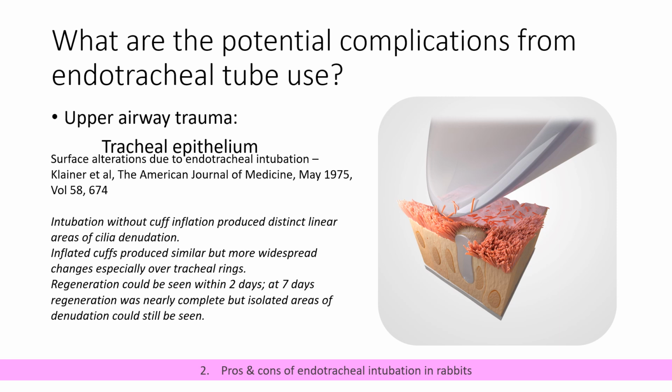When you intubate, as you can see, anywhere where you touch on that ciliated epithelium, you are amputating those cilia from the surface of the epithelial layer, and as you can see, it takes quite some time for them to grow back. And in that period, the mucociliary escalator is disrupted, and it's no longer going to be able to efficiently or potentially at all remove debris from the base of the lungs up and out of the respiratory system.